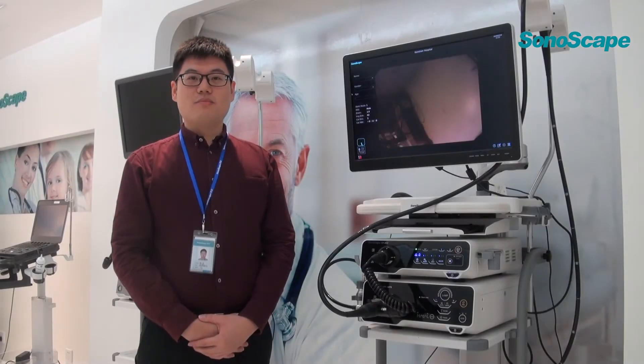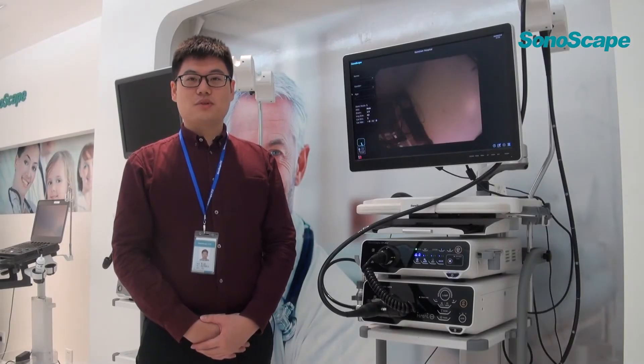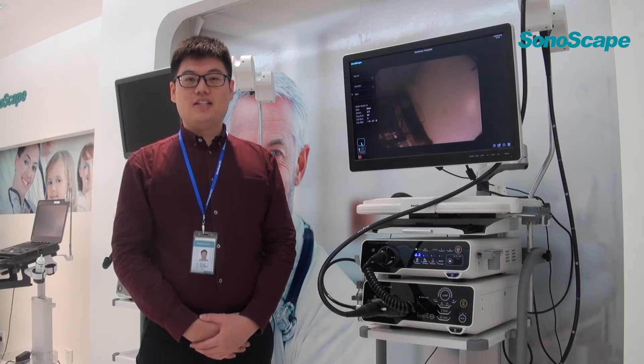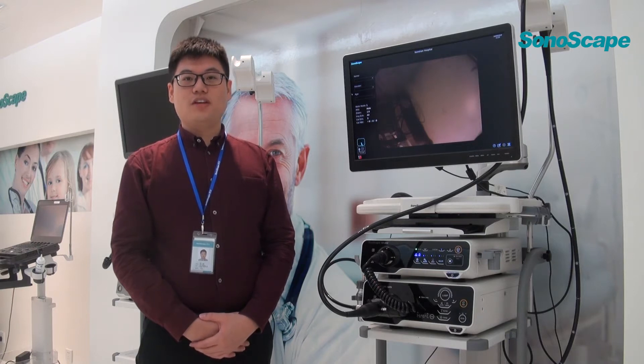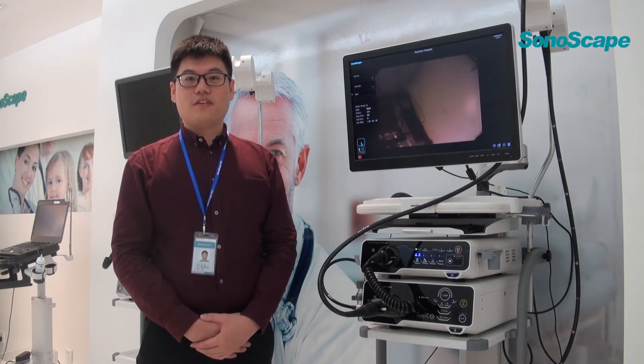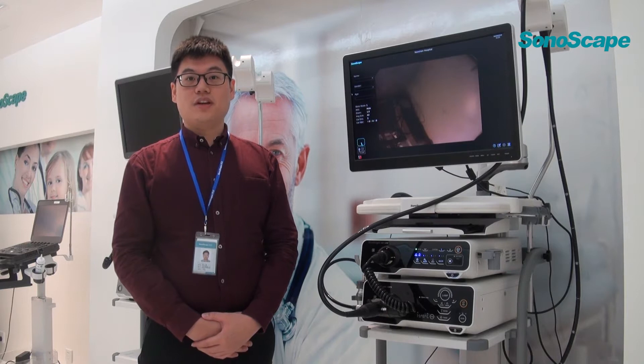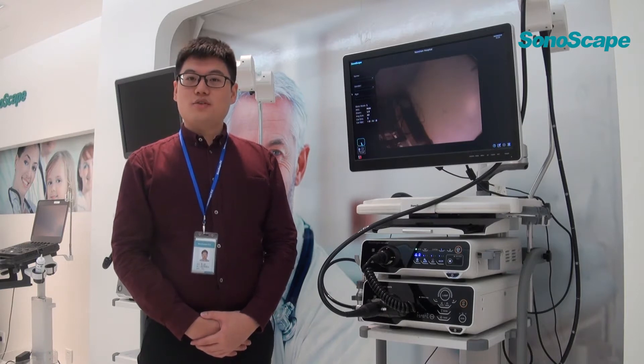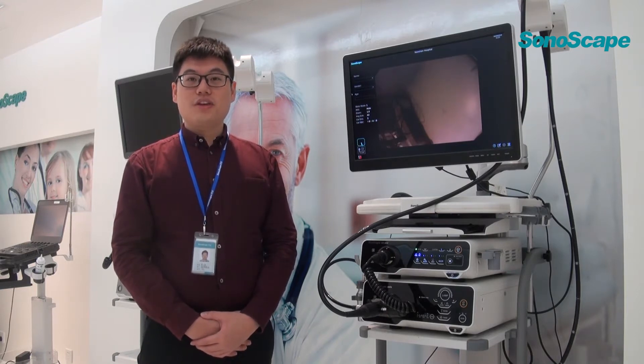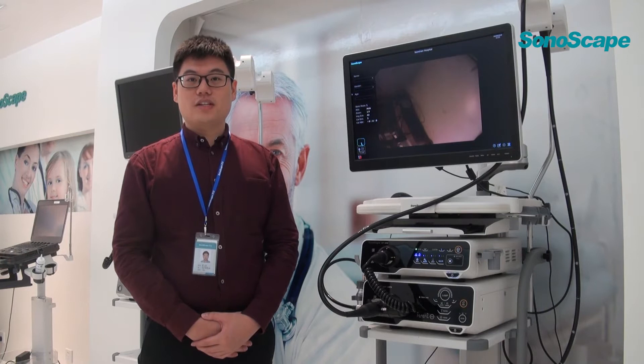Hello everyone, I'm Gavin from Sonoscape. Today I'm delighted to give you an introduction of HD500 video endoscope system. I do hope that my presentation will give you a better understanding of our product.